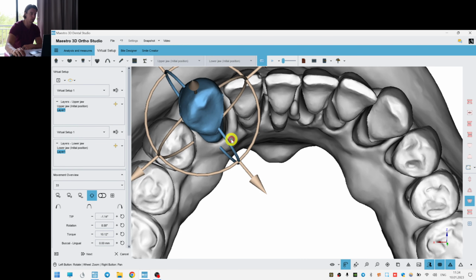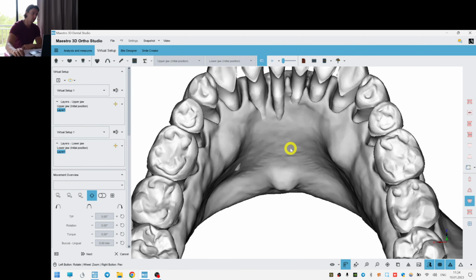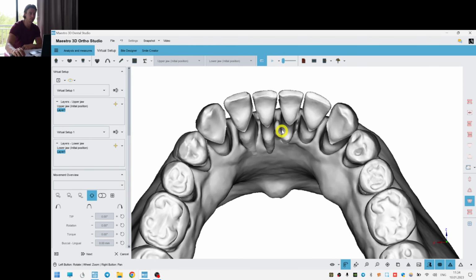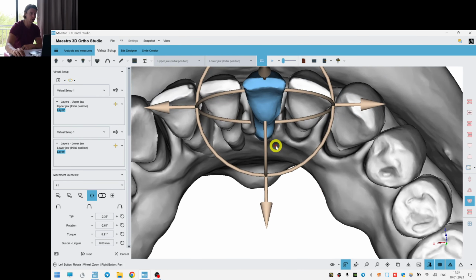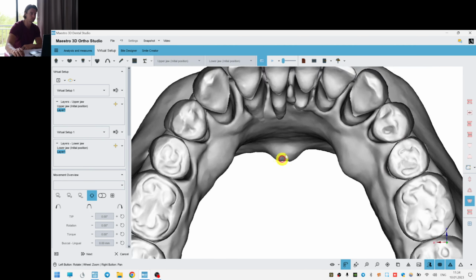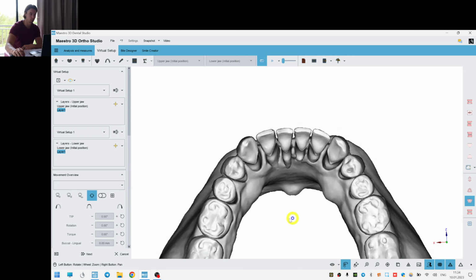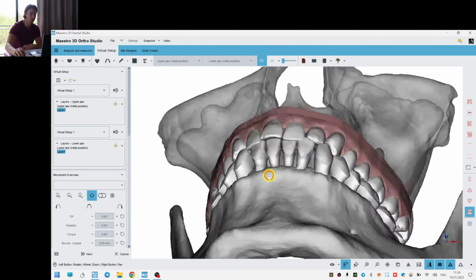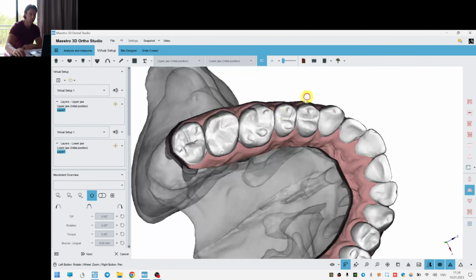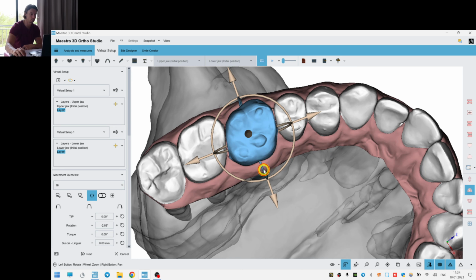We always remember that aligners don't work for like 100%. They always work for 95, 80, 85%. So if you make the movement like this, it will be more like this in real life. Well, we did some expansion here, and let's move to the upper arch to adjust the contacts before we could proceed with the lower arch.